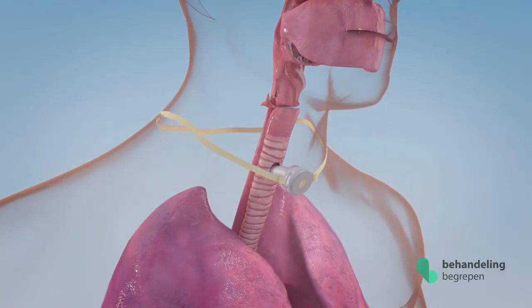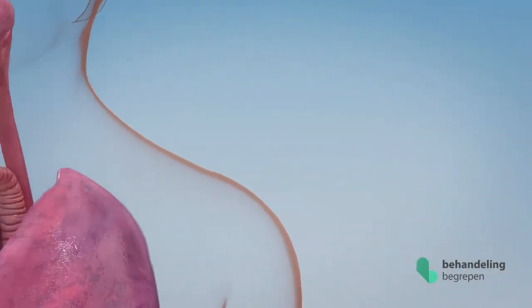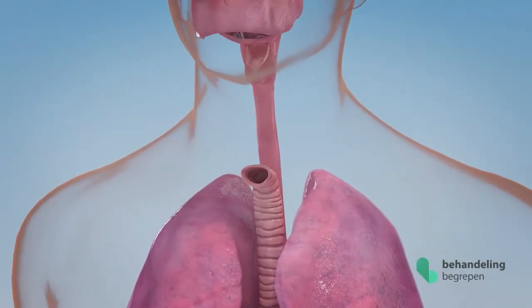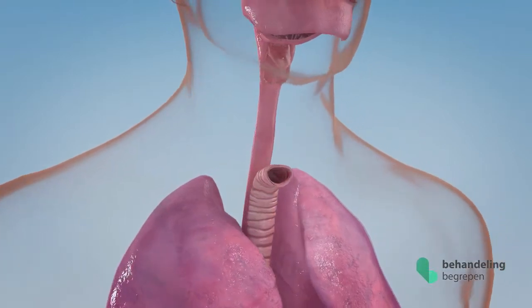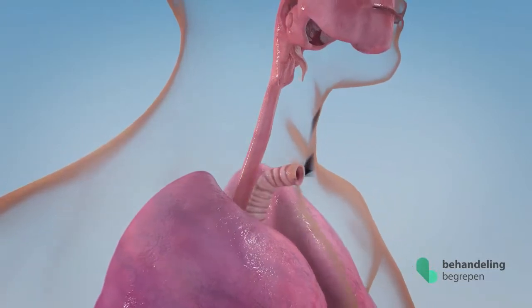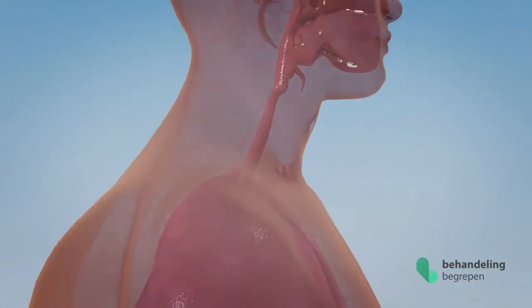This information describes aspects of oxygen administration to laryngectomy patients. This method differs somewhat from a tracheotomy. Laryngectomy patients have had their larynx removed. Laryngectomy patients breathe solely through an opening in their neck, the stoma. It is useless to administer oxygen and/or breathe air into patients through their nose and/or mouth.